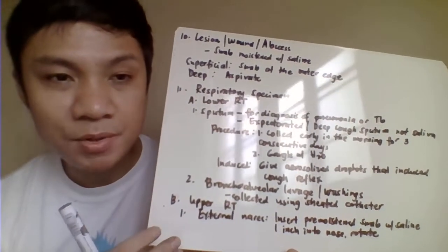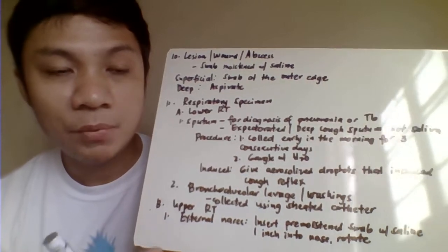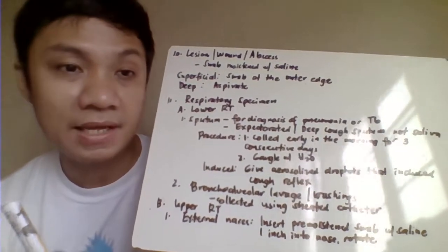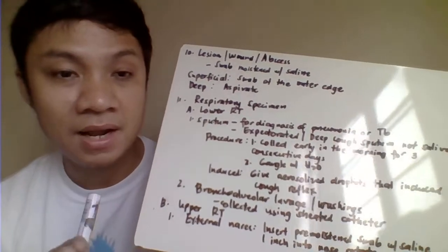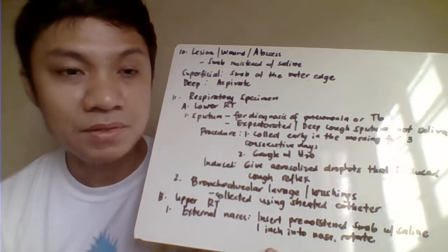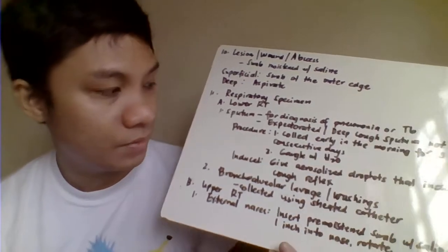When you're collecting the sputum here, you collect the sputum, hindi ang saliva. You would know here if the specimen is saliva. If you perform your microscopic identification like the gram stain, kahit magsinungaling ang patient, makikita pa rin sa result niya sa ating gram stain. Kung saliva ito, madami kang squamous epithelial cells, konti ang ating WBC.